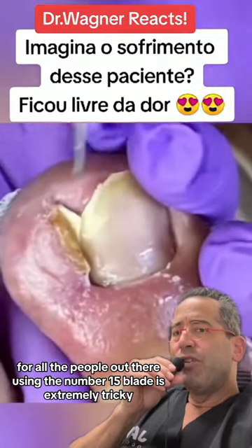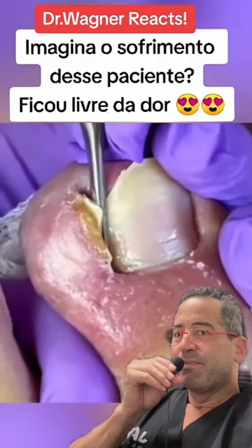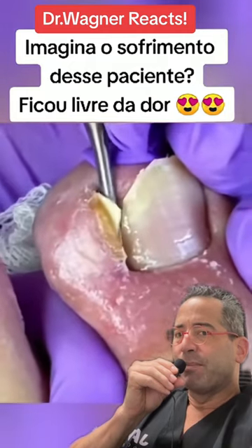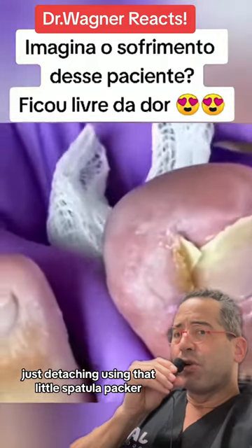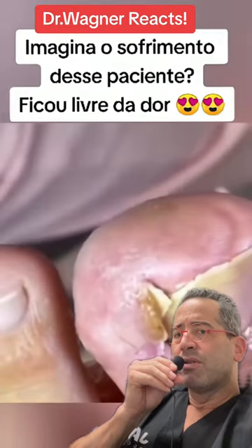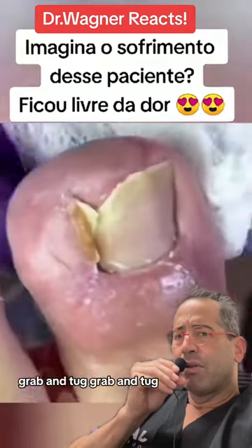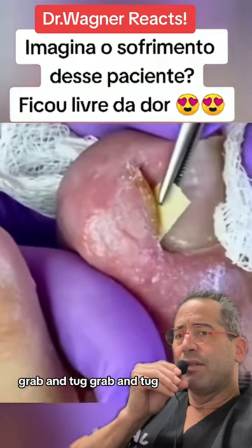No question, it takes a lot of learning. Just detaching — using that little spatula packer, detaching all the connective tissue. And now the money shot: most likely with a little hemostat, grab and tug, grab and tug.